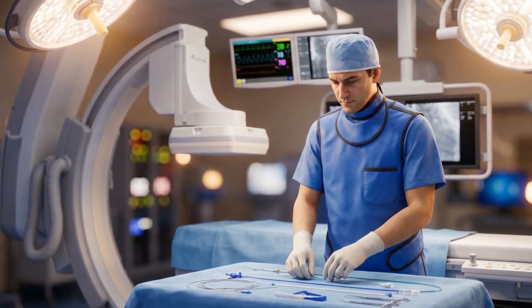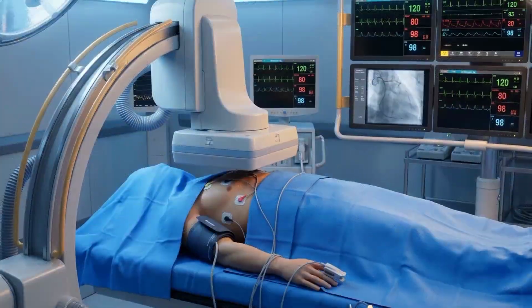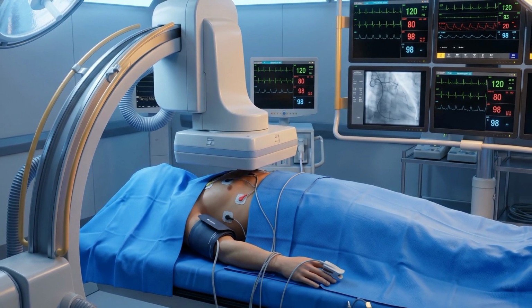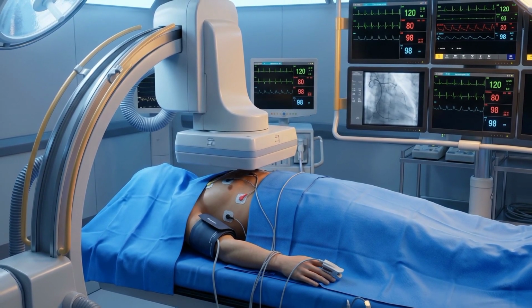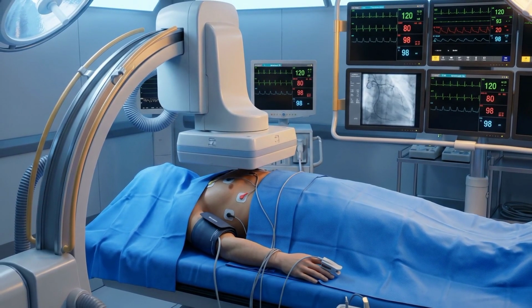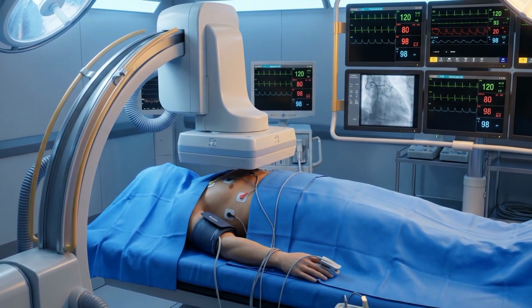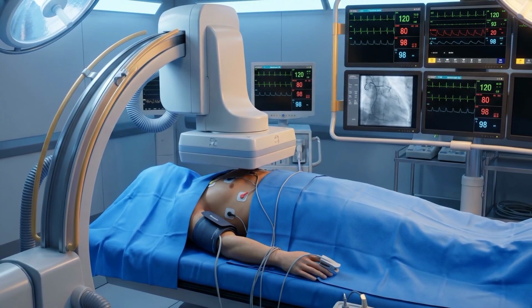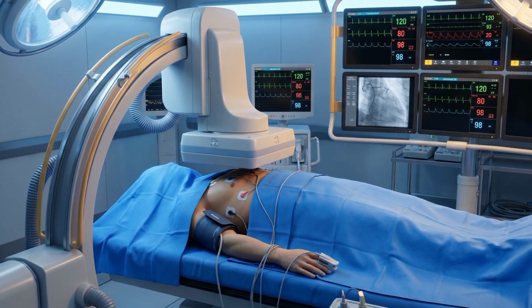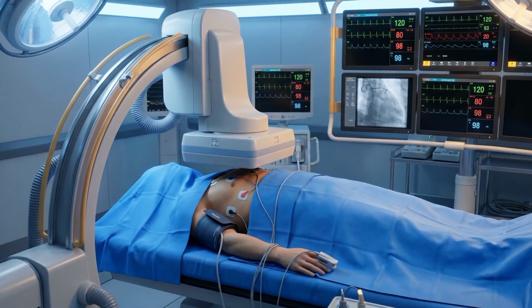Now let's see how a typical procedure works. First, the doctor inserts a catheter into a blood vessel, usually through the wrist or the thigh. The catheter is then carefully guided through blood vessels towards the heart. You can see how it will look in the upcoming images.